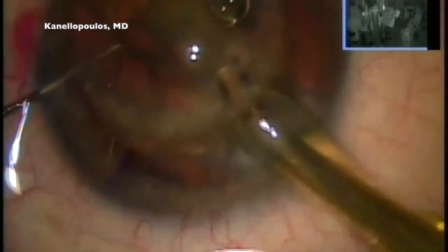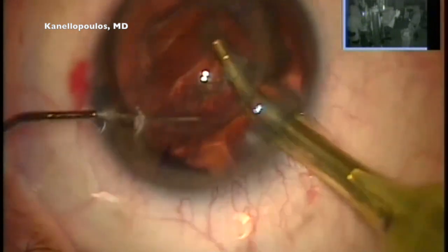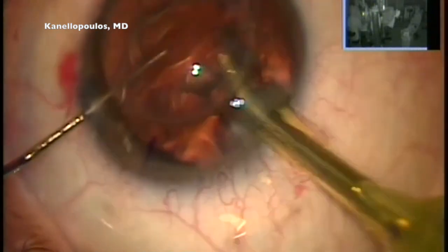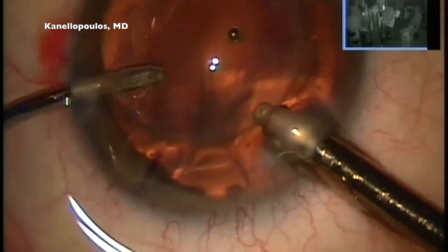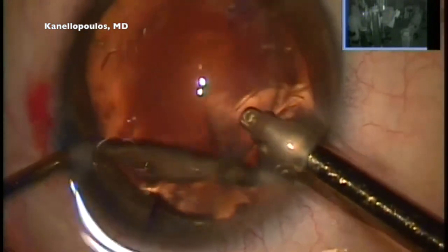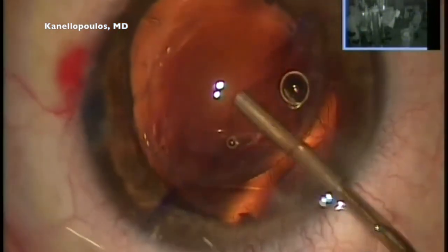We are now picking up one of the quads and replenishing the viscoelastic, going in a similar fashion as with any routine cataract procedure. We can all appreciate how impressively eccentrically this graft was trephinated and performed. Nevertheless, we're here to tidy things up, and I'm using my split aspiration through the paracentesis.